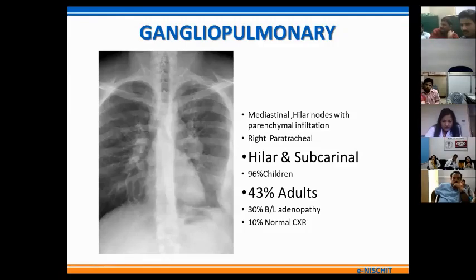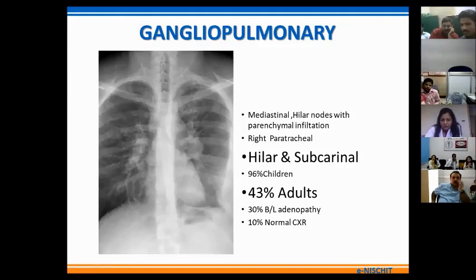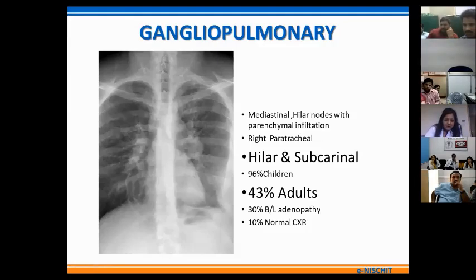In this X-ray, there is widening of the paratracheal stripe and hilar adenopathy, more marked on the left side — the left hilar lymph node appears bulky. There is subtle parenchymal infiltration in the left upper lobe and in the perihilar region on the left side. There is also a pleural effusion on the left side, causing obliteration of the CP angle on the left.